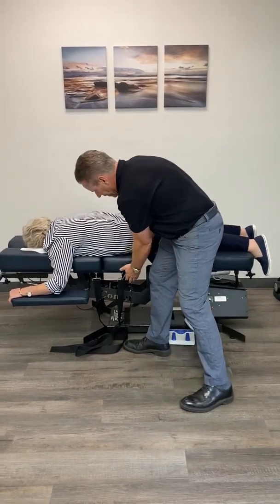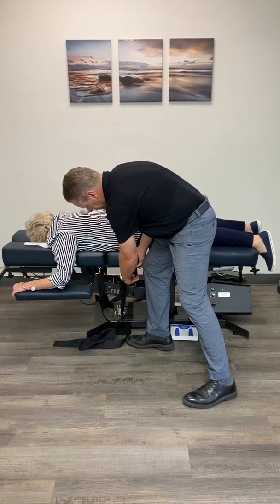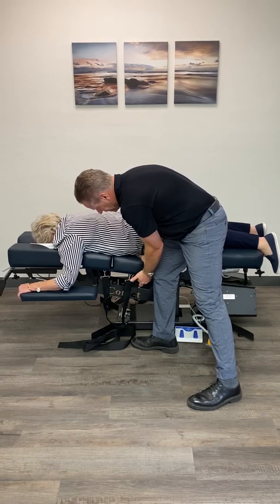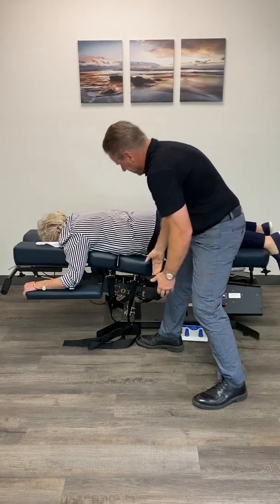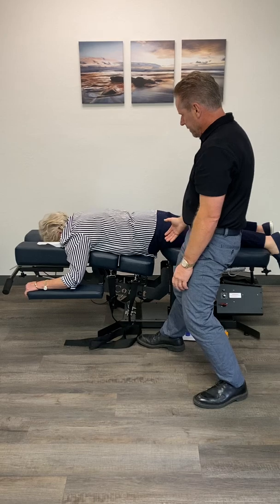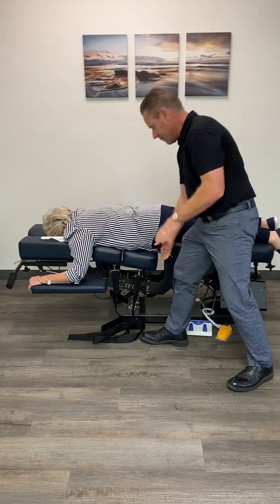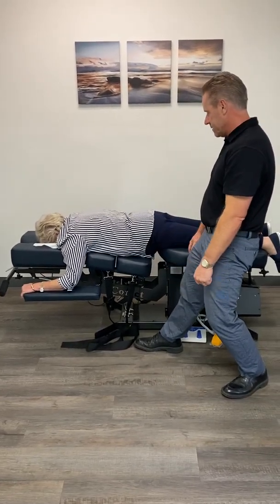I'm going to drop your abdominal section down a little bit. So I'm gonna pull up on this lever, and then we're pushing down. But see how I was holding here? Because you don't want it to startle. How does that feel right there? That feels better. And if you're not very strong, I would make this adjustment before. Most important thing is it has to be supported, otherwise that would have dropped down and surprised her, and there might have even been some discomfort there.